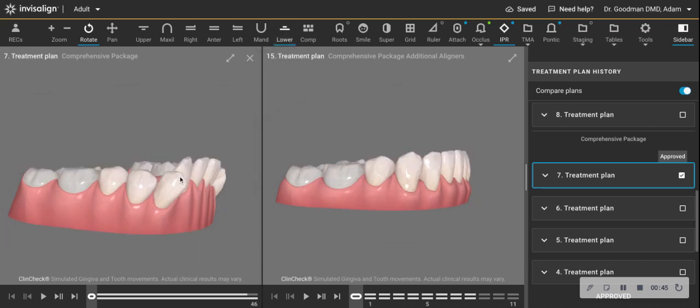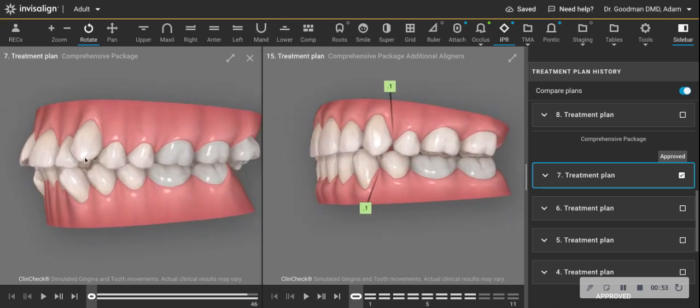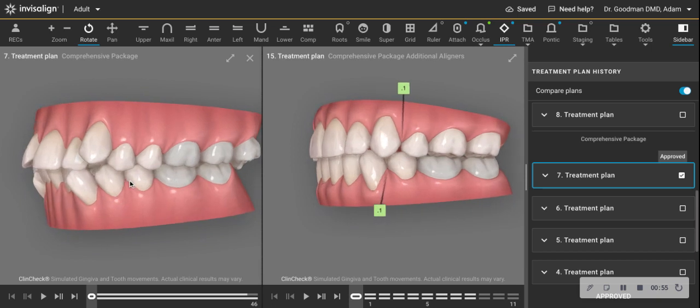is because look at how mesially angled the canines were, particularly the lowers, the uppers as well, but not nearly as much as the lowers. Now, there are limits with Invisalign as to how much you can move the roots. It is true that it is a limit of aligners that it's hard to achieve a root torque because when you have a wire in with braces, the tooth will slide along the wire and maintain its angle because the wire is slotted inside these brackets.